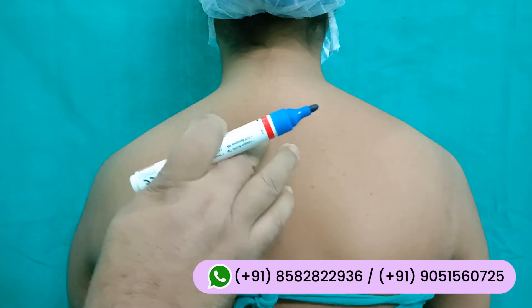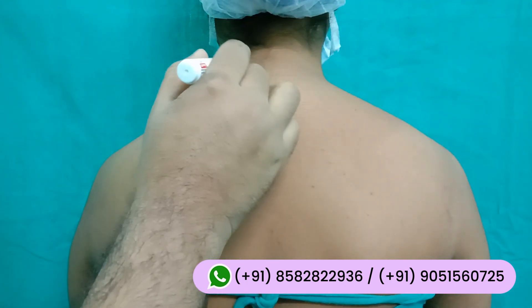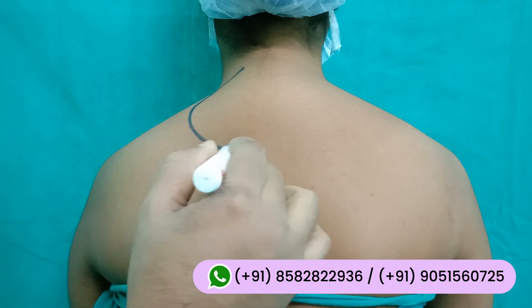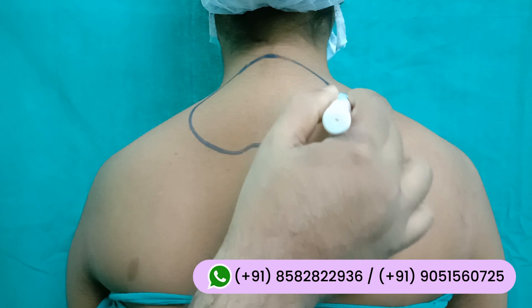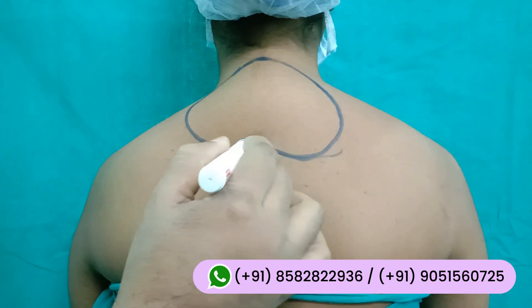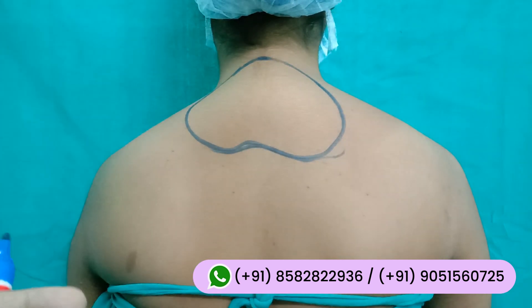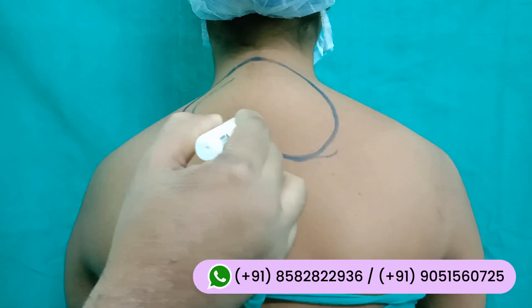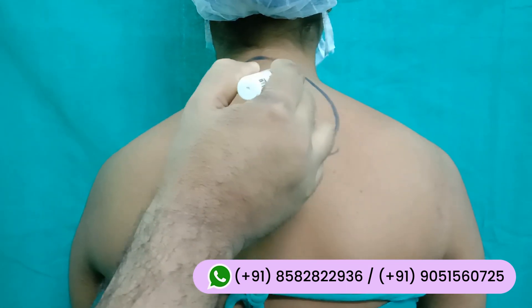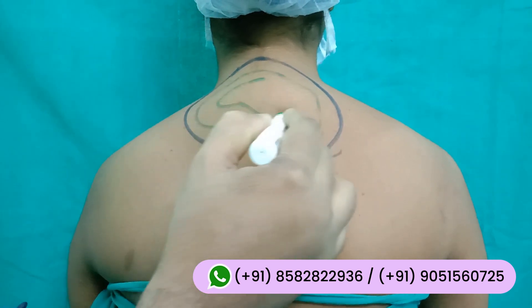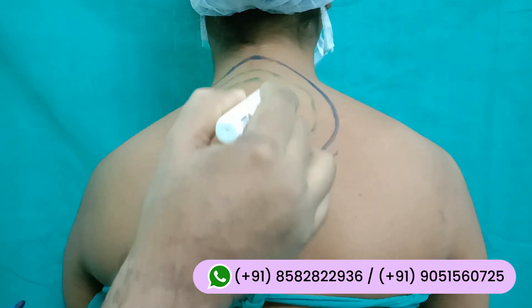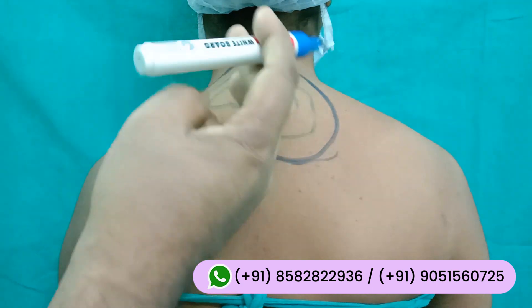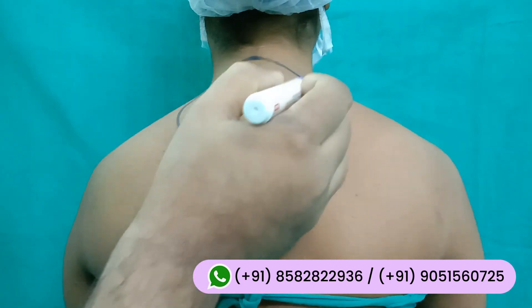So we will be doing marking for this buffalo hump. First we mark the edge of this buffalo. It looks like a love letter. So this is the buffalo hump — this is the total area, and these are the circles. Thus we mark. This is the central area.